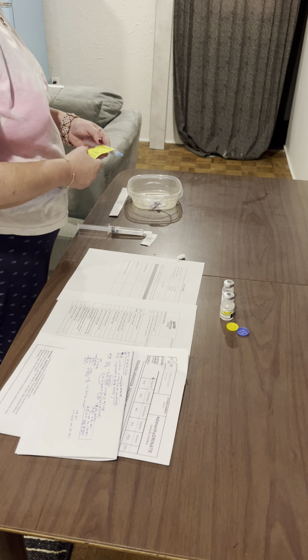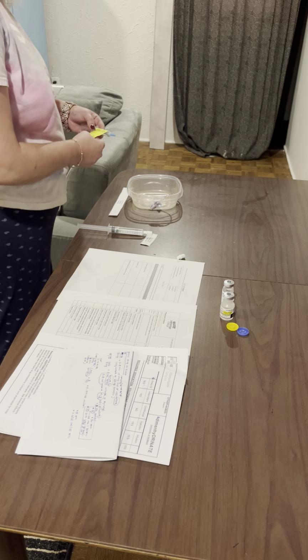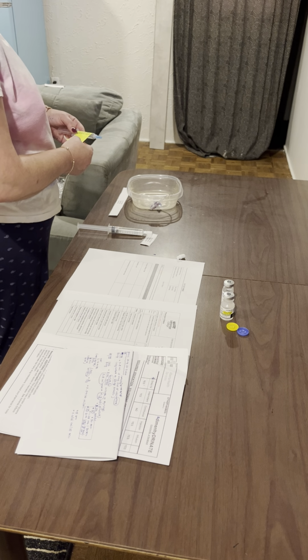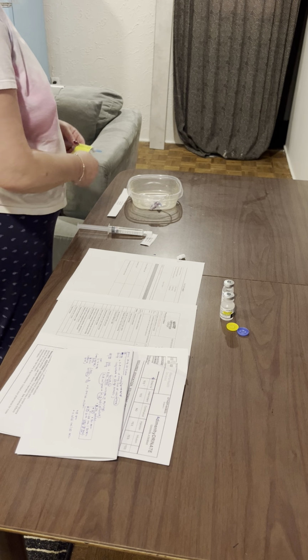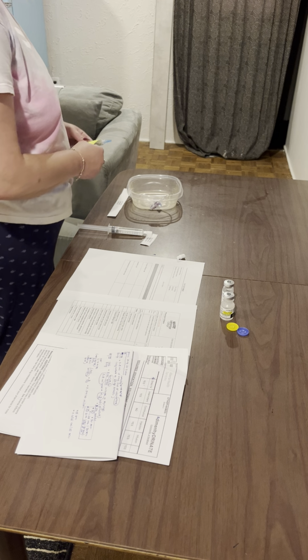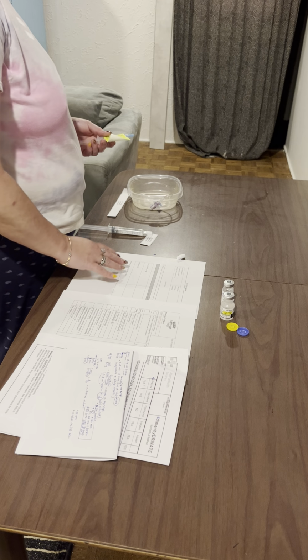And again, I like to be super careful. So Cupcake Lab, 79481, and date of birth 120358. Okay, so now what we're going to do is give the medication.